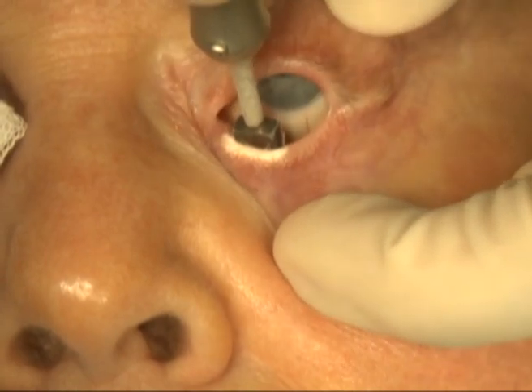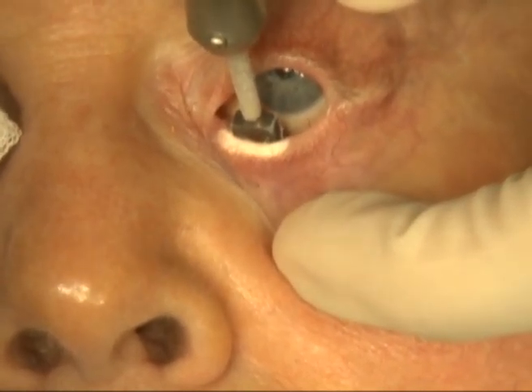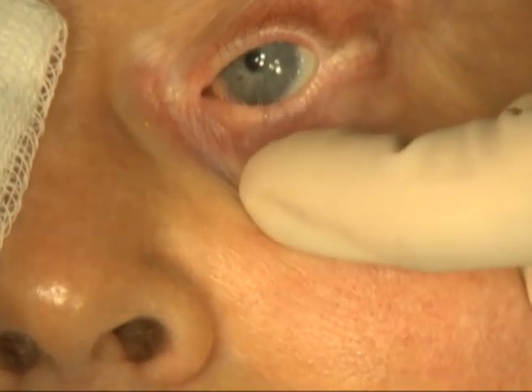You need to be aware that there is significant swelling and pain after cryotherapy to the eyelid. Also, hypopigmentation can occur and the procedure should probably not be performed in patients with significant pigment.